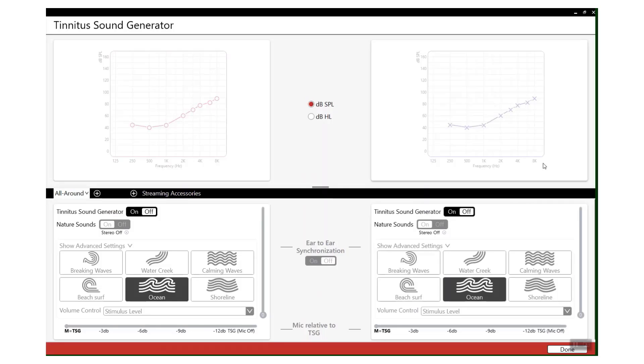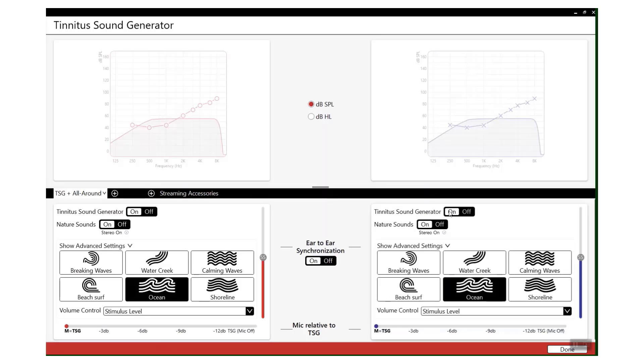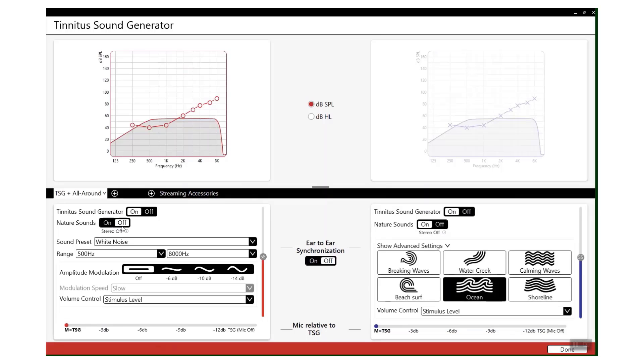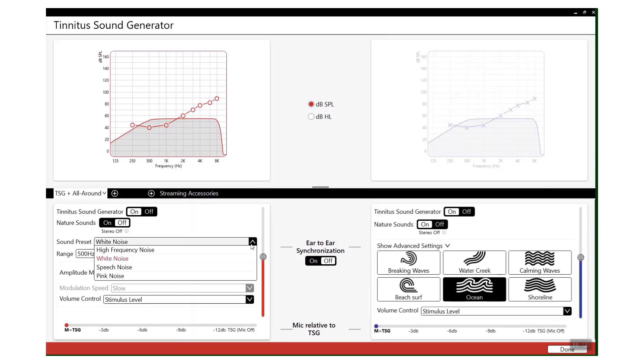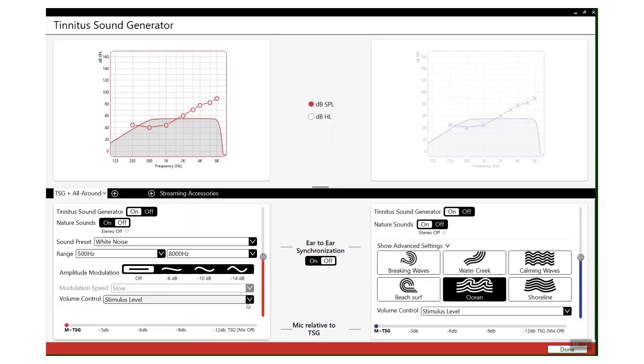So the Tinnitus Sound Generator allows you to apply different masking noises at different levels depending on what your patient needs. You can apply it monaurally or binaurally. You can have nature sounds on or off. There are plenty of different presets.